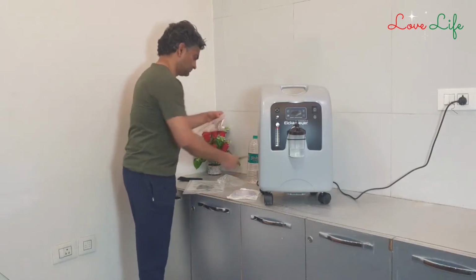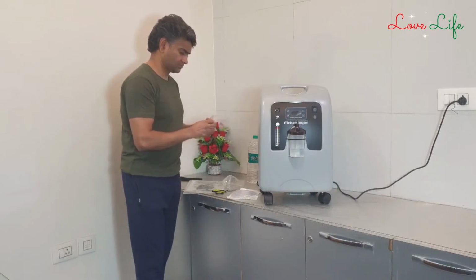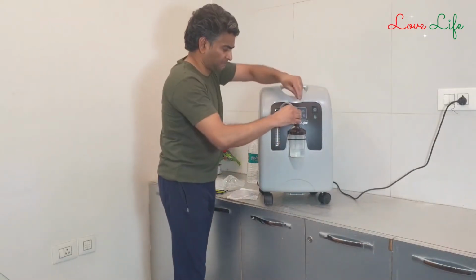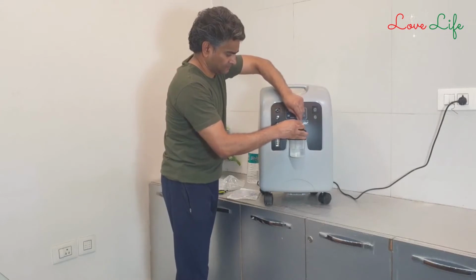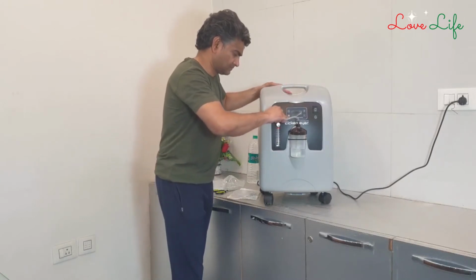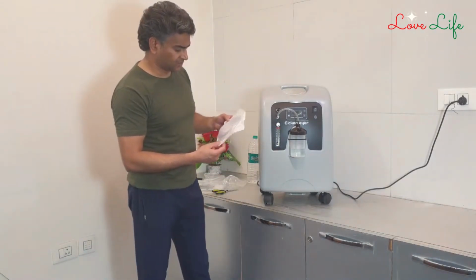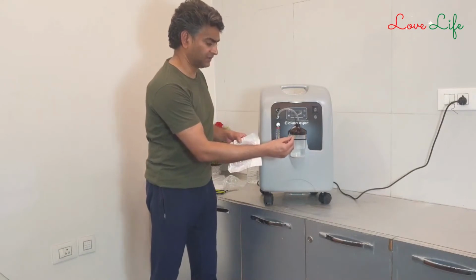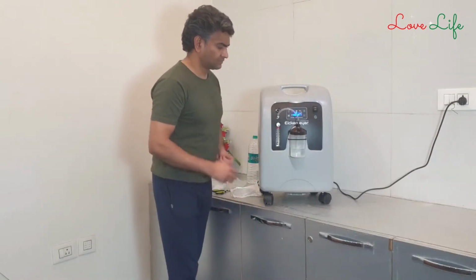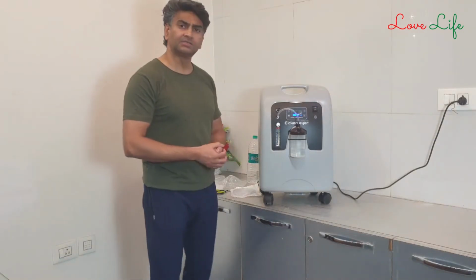This is the tubing. We need to fix one end here and plug the other end here. I need to plug this again. There is a nasal cannula which has to be connected here for the oxygen delivery. Let me turn on the machine. Okay. So the machine is turned on.